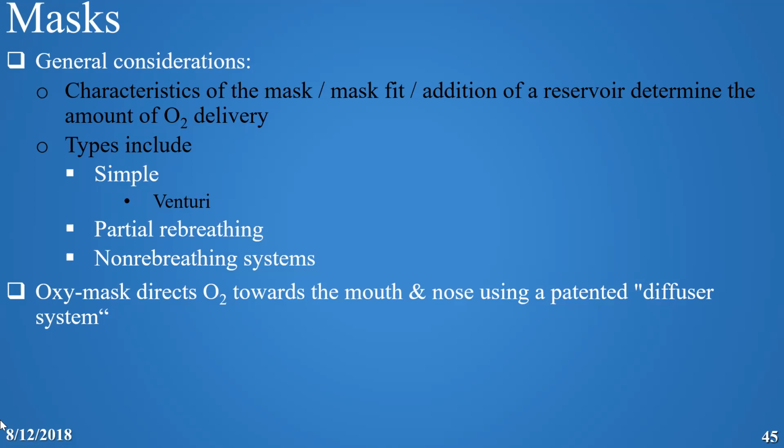There is partial rebreathing, which means one side of the holes is closed, or there is a valve that we can close and open. So with a simple mask you rebreathe. If it's only one side, it's called partial rebreathing, which means when you breathe out, you will take the same breath back because there is partial closure of the holes on either side of the mask.